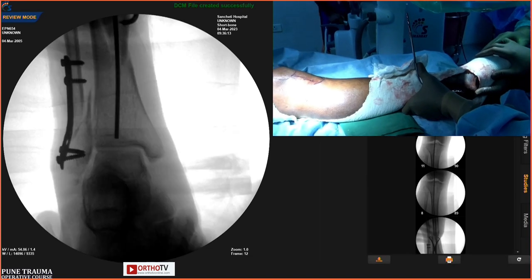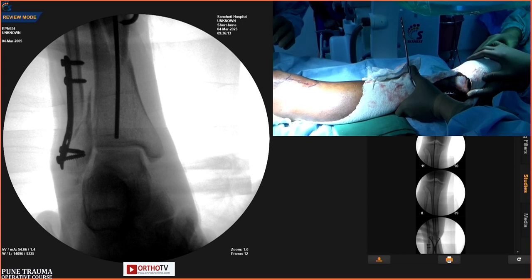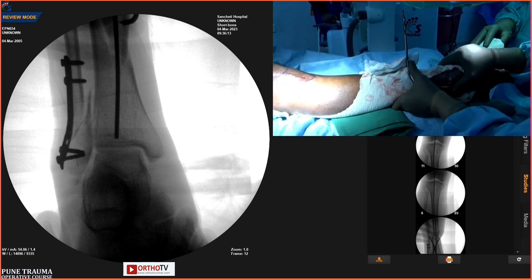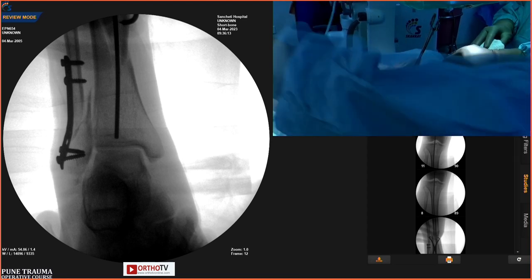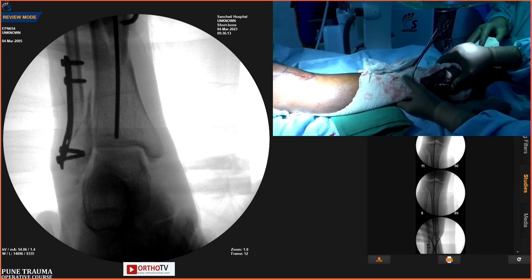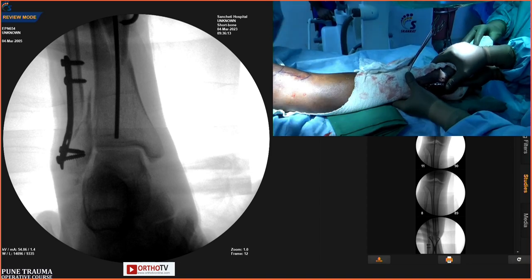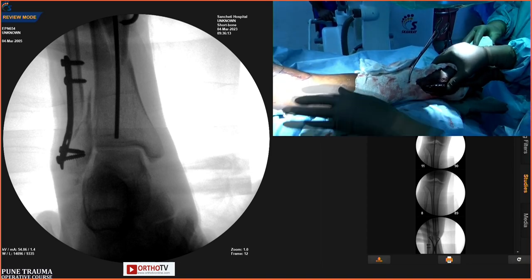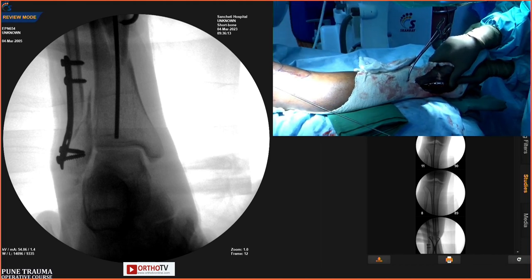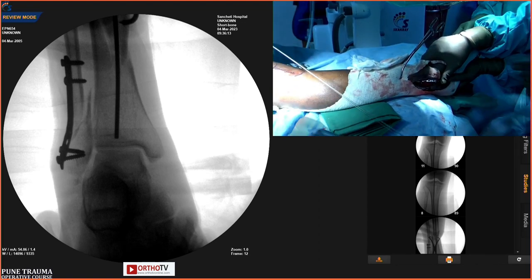Sir, are you happy? Yeah, we are happy. Now the point we are trying to make is just above the ankle level you will see a very tiny thin line. Your guide wire must pierce that and your reamer should stop there. And your nail should stop just before where the tip of the reamer ends. If in case you want to dynamize later, you will have some space for the nail to go a little in.